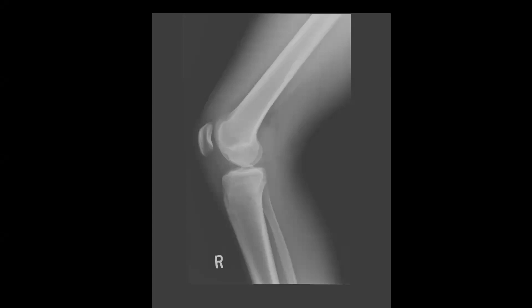Hello everyone, and welcome to week three and case three of the musculoskeletal unknown case series. This is one of my favorite cases, so I hope you enjoy it as well. This is a 26-year-old football player coming in with right knee pain, and here we have a lateral x-ray of his right knee.